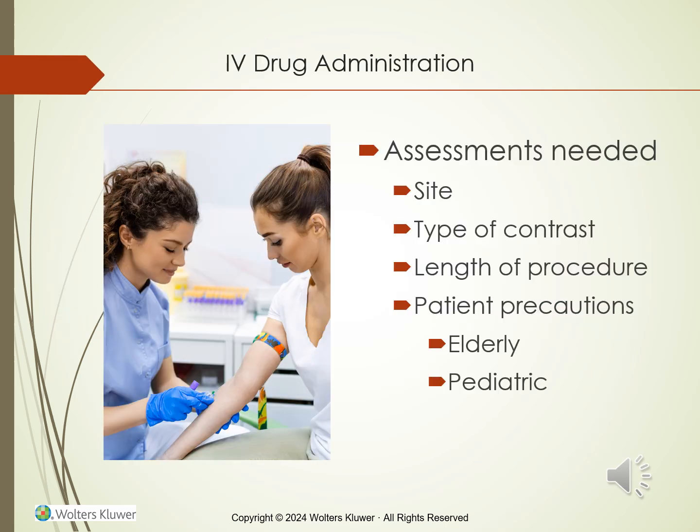When getting ready for an IV drug administration, you need to assess the area that you are going to put the IV in. You need to consider the type of contrast, the length of time, and the age and physical condition of the patient before you even begin to determine what needle you will be using and what procedures, etc.